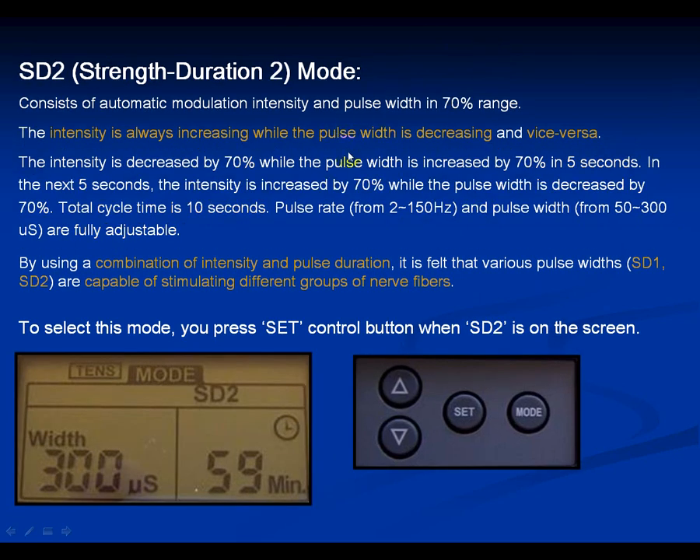Strength Duration 2 is the same as Strength Duration 1 except it uses a 70% modulation range. Pause this screen, turn the device amplitudes down, change the mode to Strength Duration 2, adjust the pulse rate, pulse width, and timer, and get an idea of what this feels like over 5 to 7 minutes. Practice all five modes — Burst, Normal, Modulation, Strength Duration 1, and Strength Duration 2 — on the same muscle we're training on. You can pause each slide and practice for a while with your device.